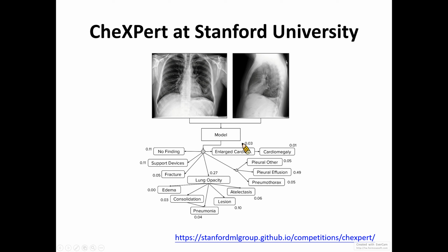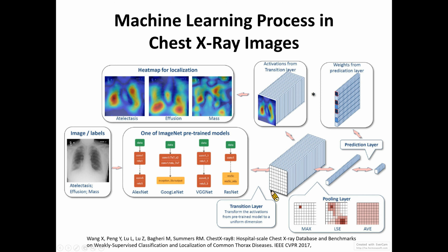So I provide the internet link in these slides for you to explore this data set. And for this model, we need to develop very sophisticated algorithms. So this is one example of using deep learning to develop these very complex models.